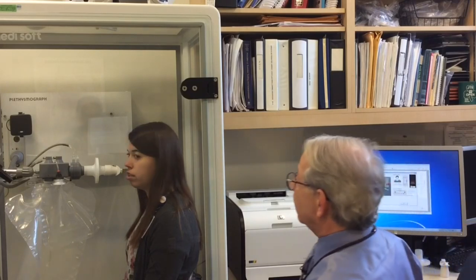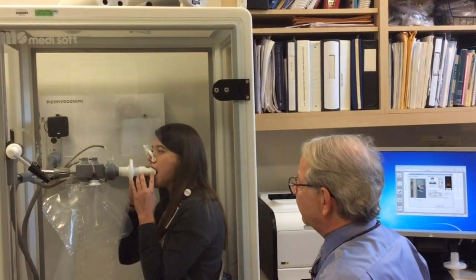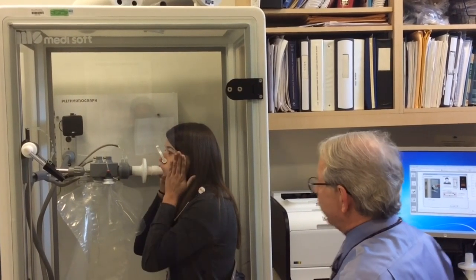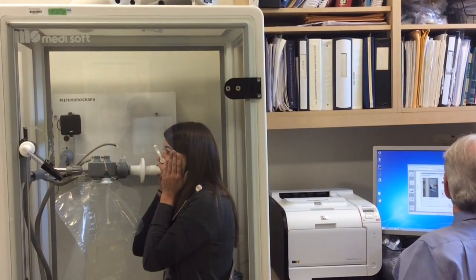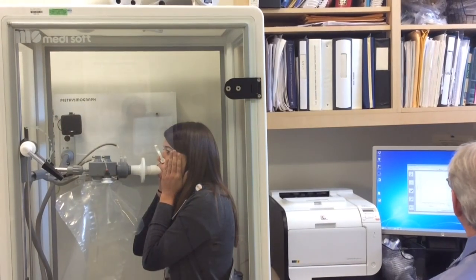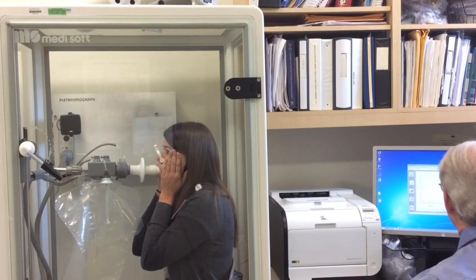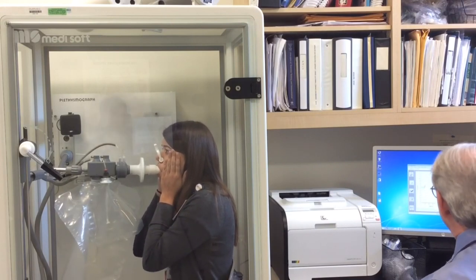Okay, we're ready. So mouth on the mouthpiece, clips on the nose, good. Hands on the cheeks, and just breathe normally, please. Another easy breath. Okay, start to huff in and out, huff, huff, huff. Keep going, stay with it, up against that shutter, good.